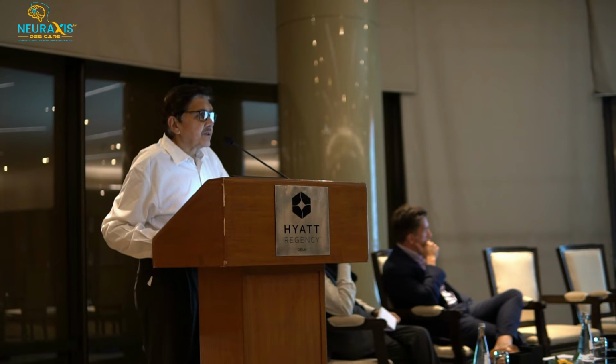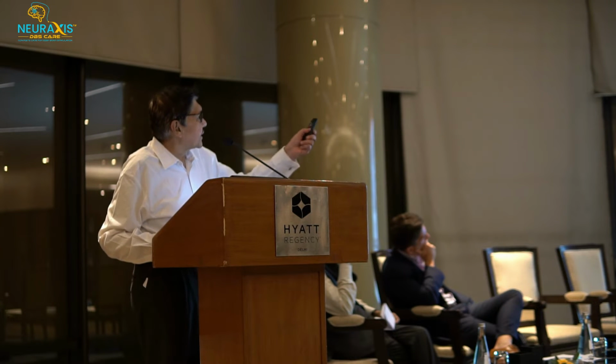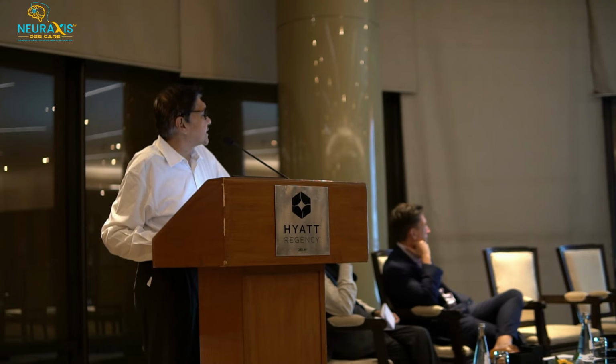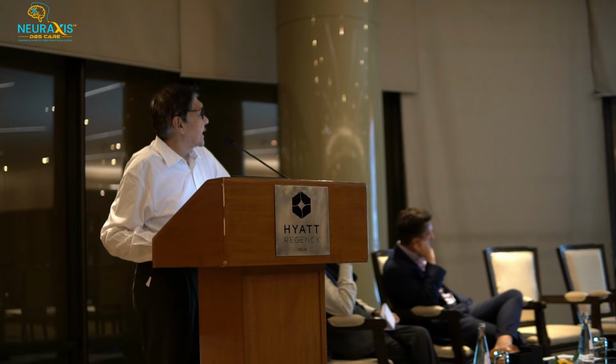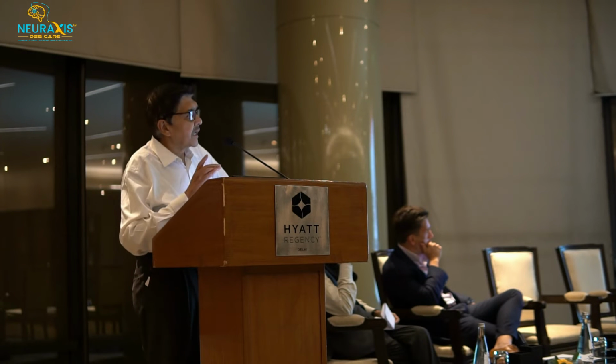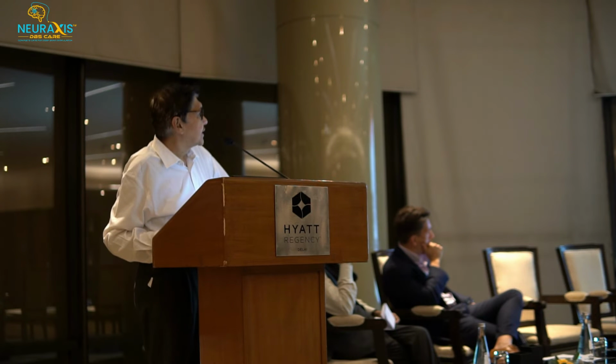Once we have decided our nucleus and our trajectory, then we put another frame on the patient's head, which is called a stereotactic arc. We also use the image for guidance, and based on these coordinates we make an entry point, we make the burr hole, and then we pass the micro electrode for the recording. So we have done the anatomical localization, we have done the stereotactic localization, and now we will go for the neurophysiological localization of that nucleus.